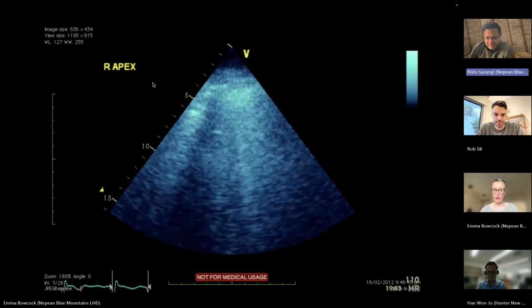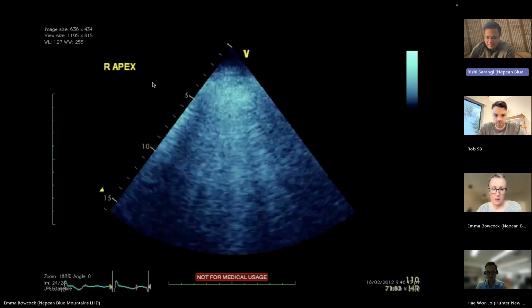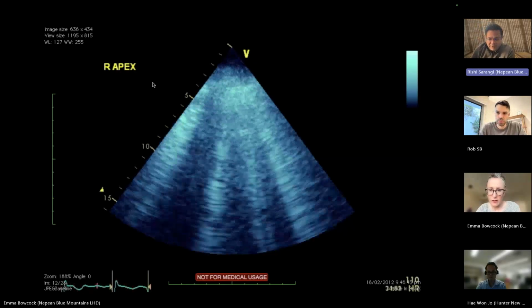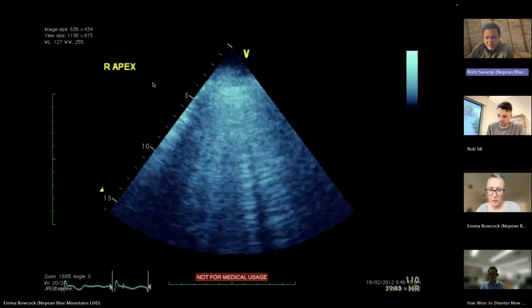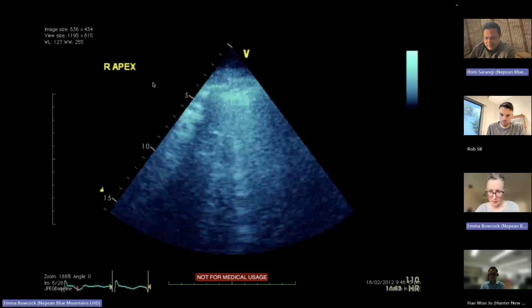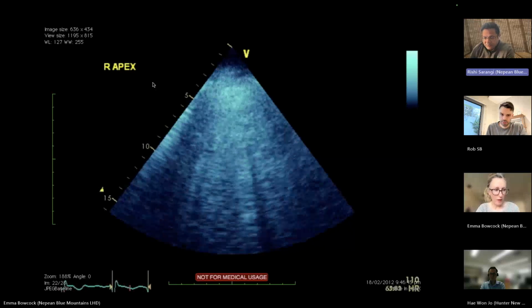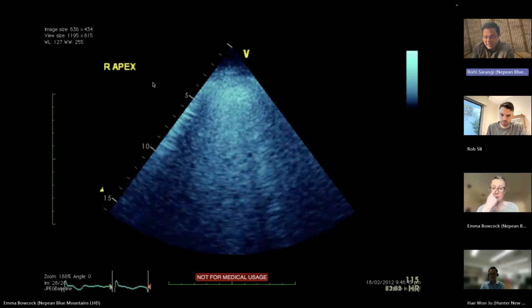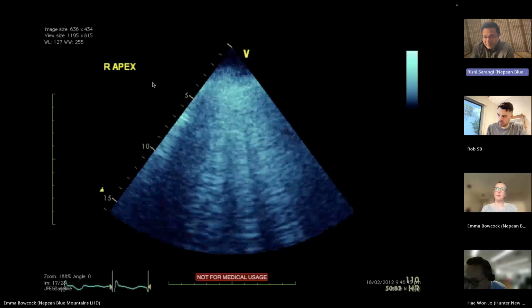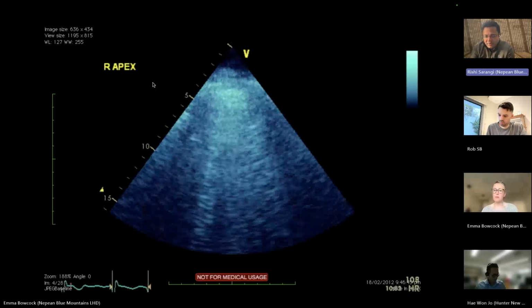So we're looking at a lung ultrasound at the right apex, which shows prominent multiple almost confluent B lines emanating from the pleura, which is suggestive of interstitial edema. What could be the cause of that, Rishi? So the cause could be either infective or non-infective. Infective causes could be pneumonia from multiple microbial infective causes. Non-infective causes could be cardiogenic pulmonary edema, inflammatory pneumonitis, or any hemorrhage.